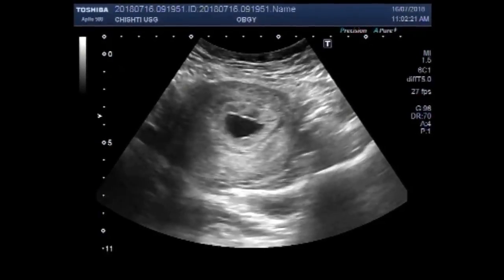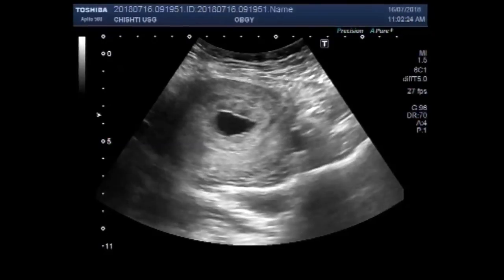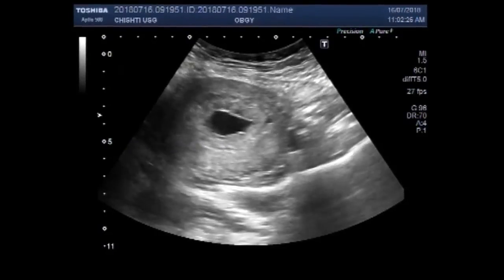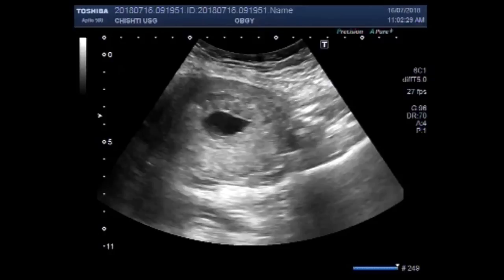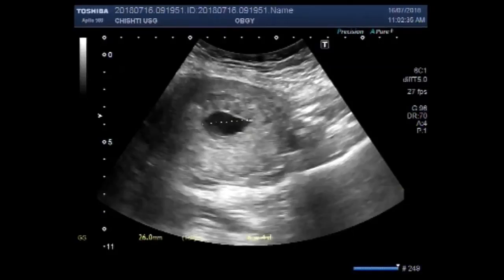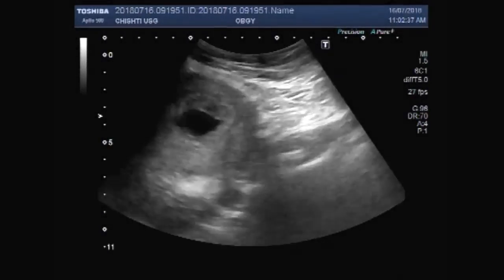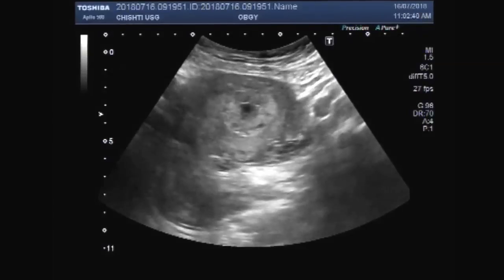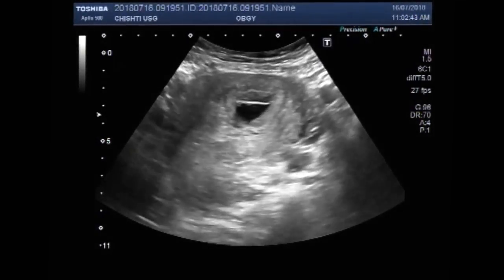There is no history of bleeding per vagina. Now you can see the measurement of the gestational sac. It measures about six weeks four days, or approximately six and a half weeks.